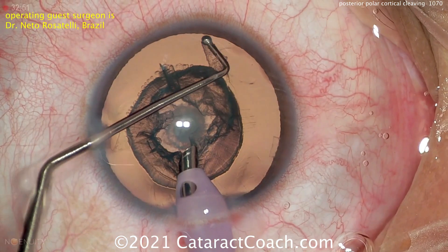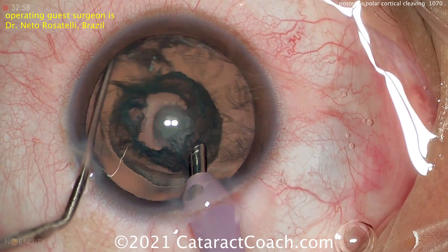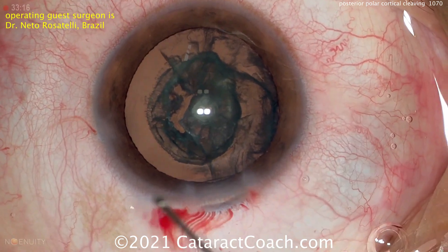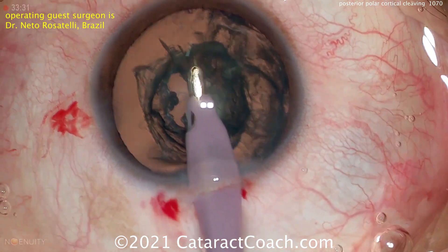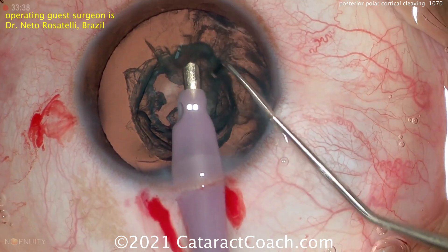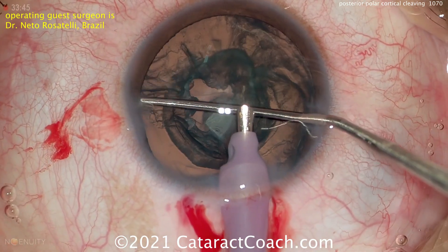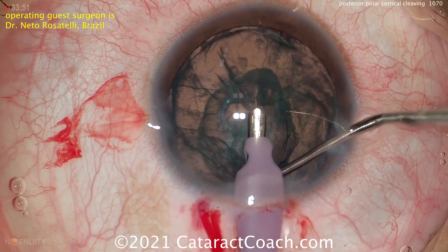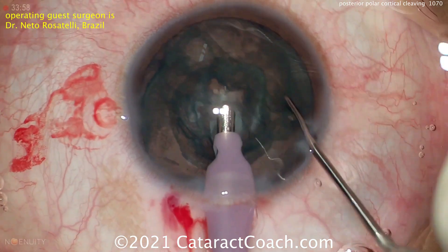Watch carefully now. This hook instrument is being placed to mechanically separate the epinucleus and even some of the cortex from the capsular bag. Now switching hands — this is why you have to practice with your non-dominant hand. Phaco probe in the left hand, chopper going in the right hand. Dr. Rosatelli can use both hands equally well. Passing this hook instrument and separating that cataract from the capsular bag, nice and easy.